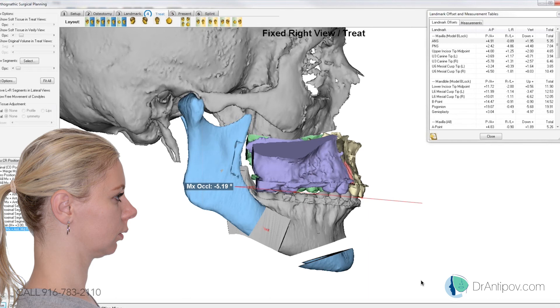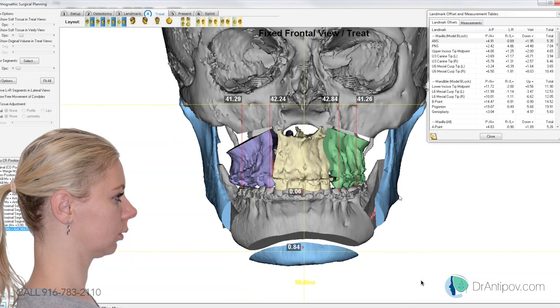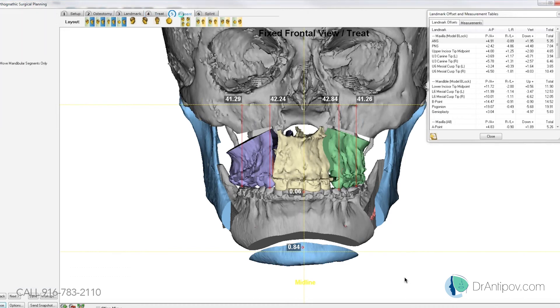Can we change the occlusal plane just a smidge — just very very little? Do you want to increase or decrease it? Decrease — I'm sorry — decrease. Back down to 5, yeah — 5.1 degrees or something. So that's about 20 millimeters Pogonion. I think that's pretty good right there — I like that because I can always advance the chin another millimeter to 20.